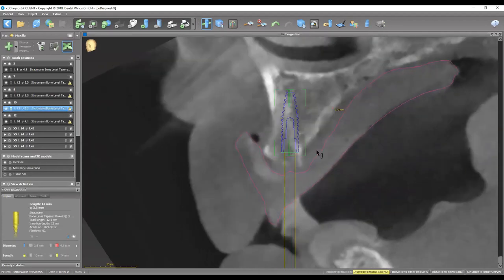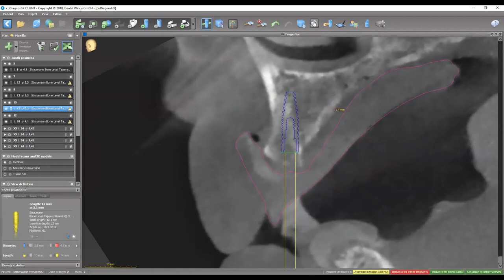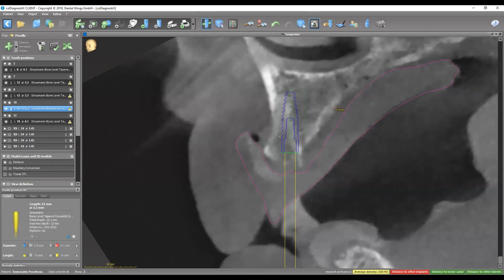Moving on to number 10 or 11 — also a 3.3 by 12. The bone here is a lot softer. Measuring the density, it's almost around 200 to 300 Hounsfield units, which is around D4 to D3 bone. Knowing that before going in would give me more idea of what additional surgical procedure is needed — in this case, I would do some bone expansion or ridge expansion, or undersizing of the osteotomy.